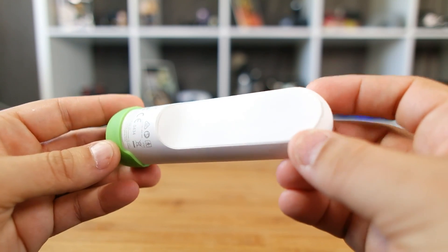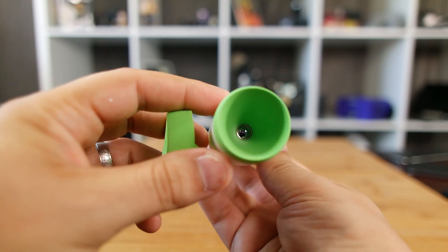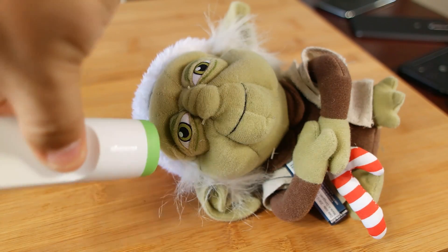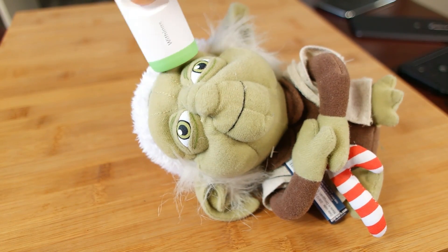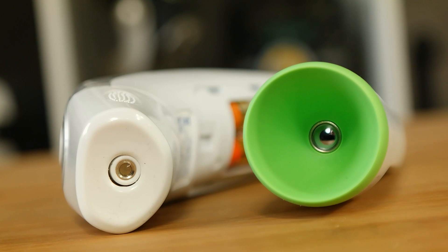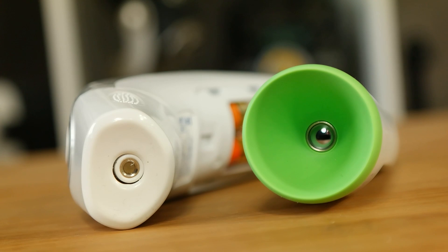Scanning the forehead has become a popular trend as it's a bit more sanitary than shoving a stick into a sick kid's mouth, potentially spreading that yuck to other people in the home. Thermo takes one additional step in providing a powerful enough scan that you don't need to even make contact with skin to get a somewhat accurate readout. The sensor is buried so deep into the housing that even if you do press this against skin, there's minimal contact.